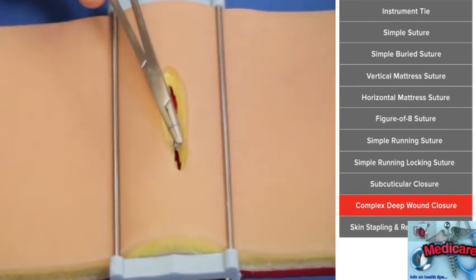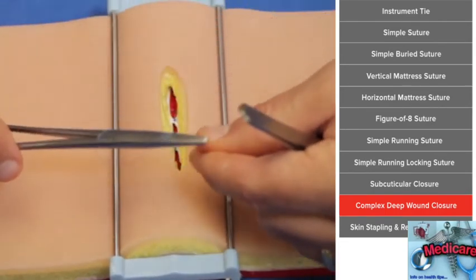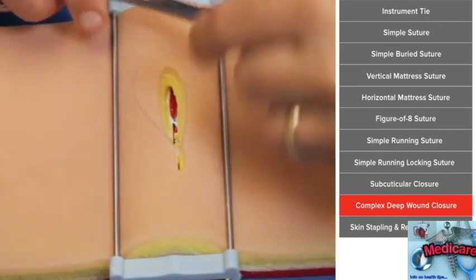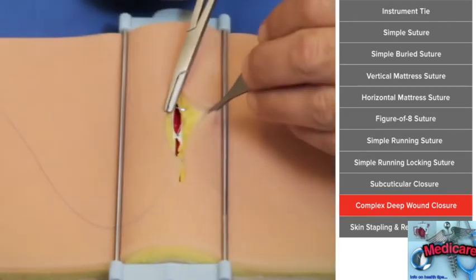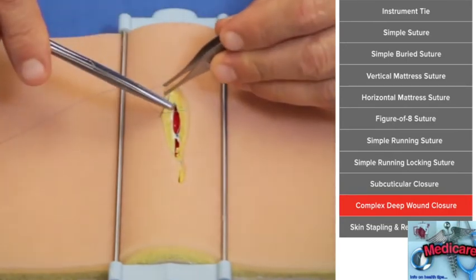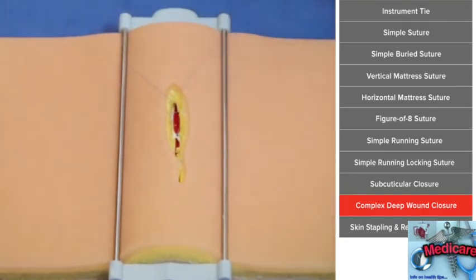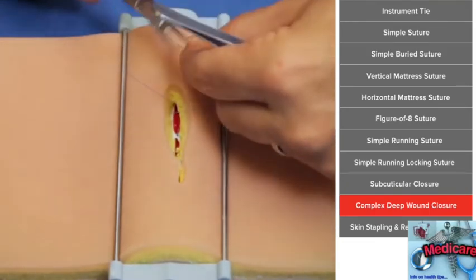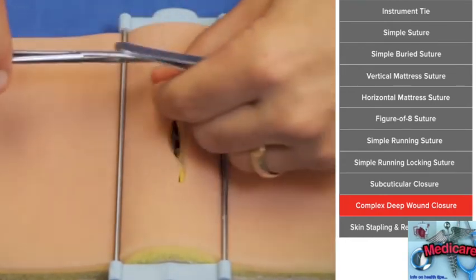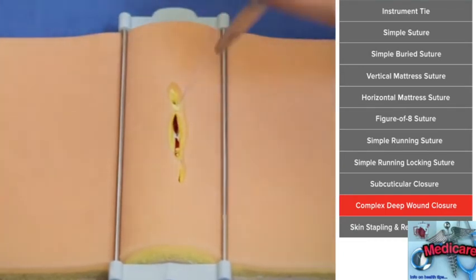You can see there is some tension on this wound, and I think that's what I like about this demonstration and this type of model, is that it is realistic, and you can set this tension as much as you want, and early on you'll be able to close the ones without tension pretty well, and as you start moving along you want to put more and more tension on and see how good your knots are and how good your suturing is. Another word of advice I would give you is notice how I'm going to the ends first. The ends have the least amount of tension, the middle of the wound gapes open the most, and I think most of the time people want to close the middle first.